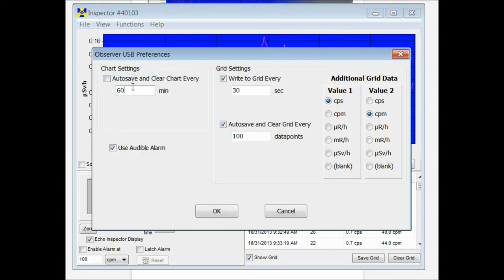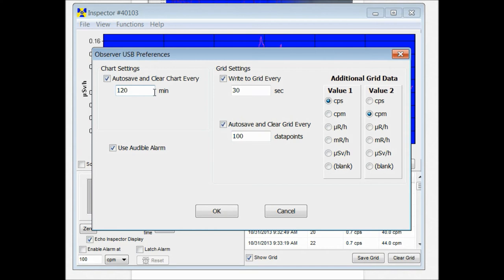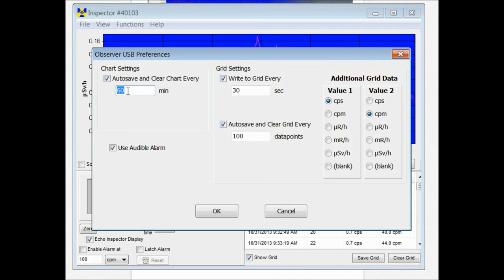In the chart settings, you can have the chart auto-save and clear the data every pre-programmed time frame. I'll make it 120 minutes, you can make it every 60 minutes. This makes it so that your chart starts over depending on whatever specified time you put into that field there.